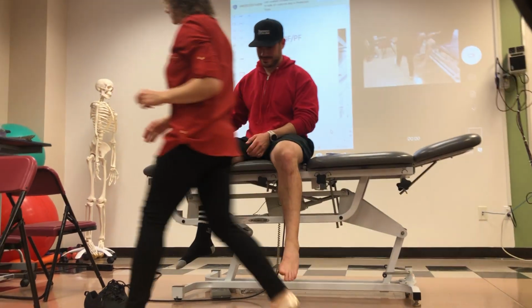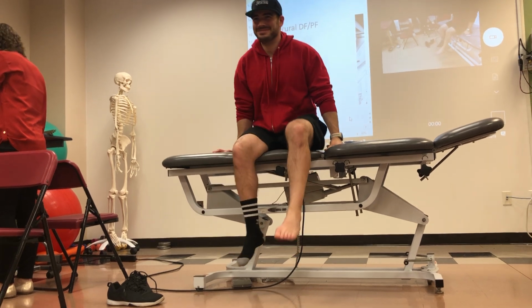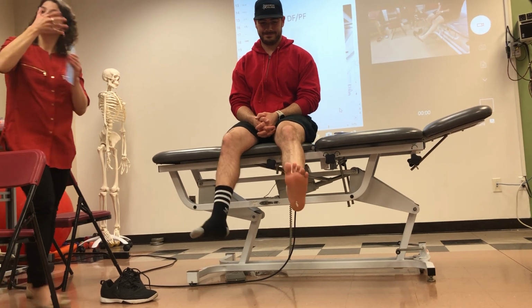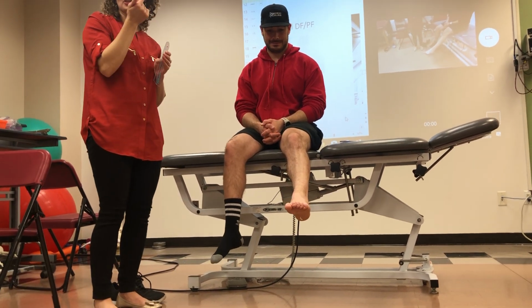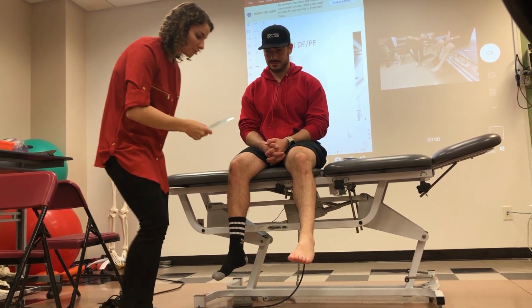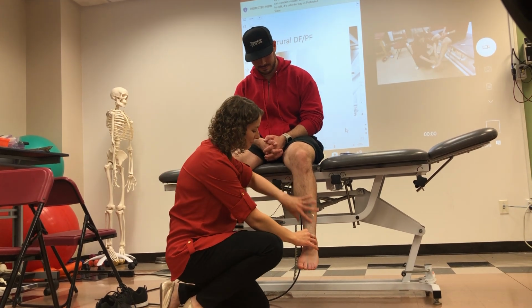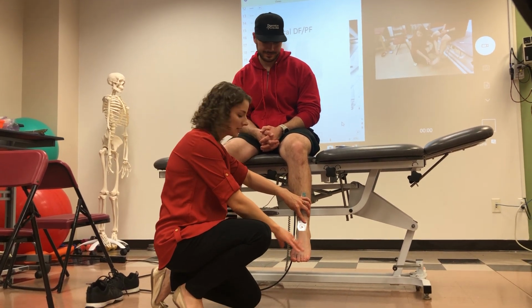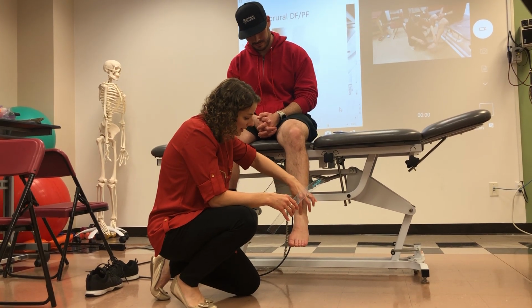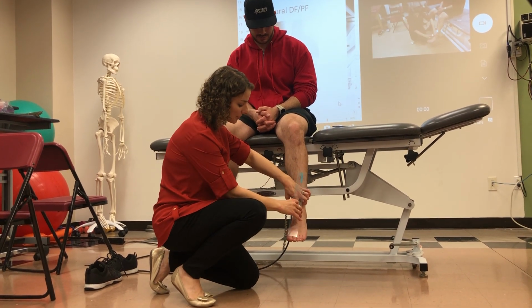For inversion and eversion, it's typically going to be easier to use a goniometer that is slightly flexible. So this is measuring global ankle inversion and eversion. We'll also be measuring more specific subtalar inversion and eversion. But for the more global measurement here, a flexible goniometer is helpful so that you can bend it along your bony landmarks. So the landmarks for inversion, eversion are in the midline right between the lateral and medial malleolus, which is where the fulcrum goes.